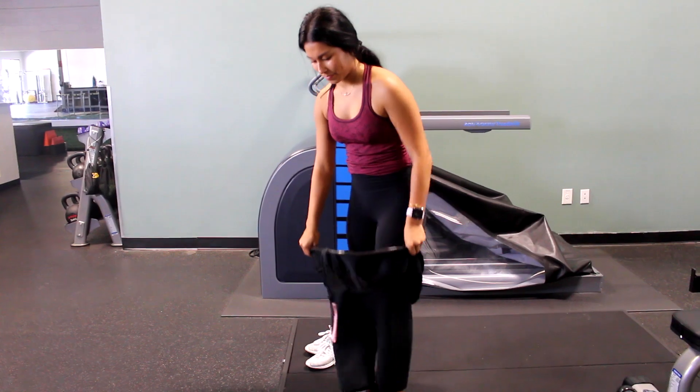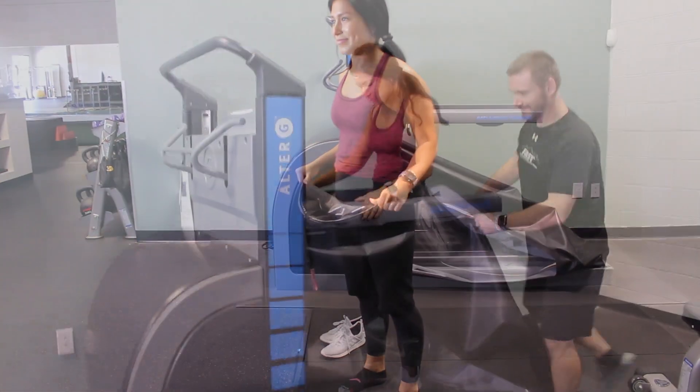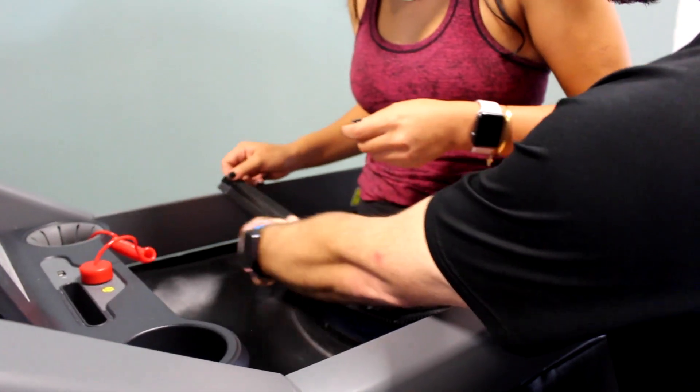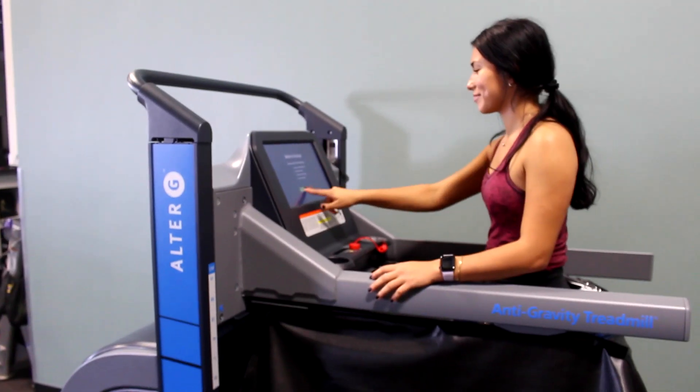The Alter-G anti-gravity treadmill offers an innovative approach to recovery, training and injury prevention. With its NASA-patented Differential Air Pressure System, patients can run or walk at nearly any stage of the rehabilitative process pain-free.